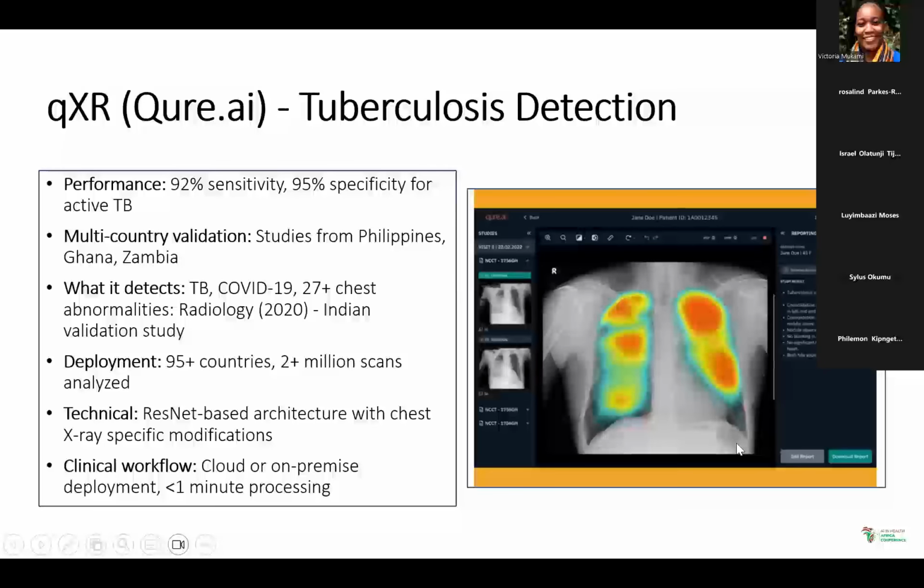You would look at the diaphragm, the spine, probably have a look at the bones around here, then the heart, then finally you would come to the lungs, and you would look at each lobe individually, and you'd take a long time systematically going through this. What this does is that all for you, so you can just go to the area where there's maximum chance of pathology, which reduces the time for doctors to look at the X-rays. Again, doesn't replace them.